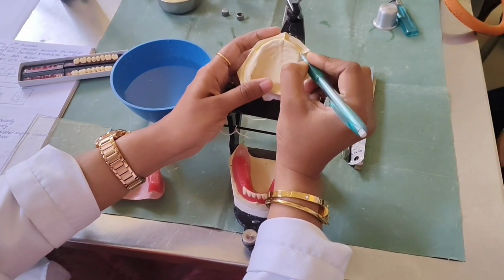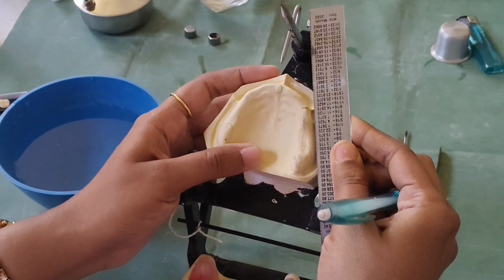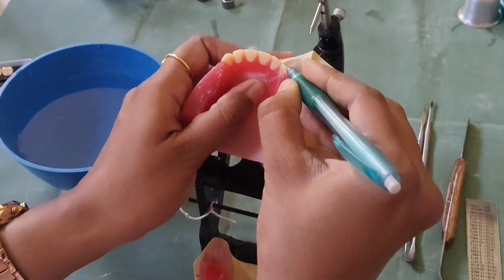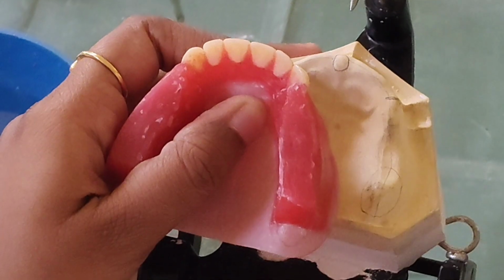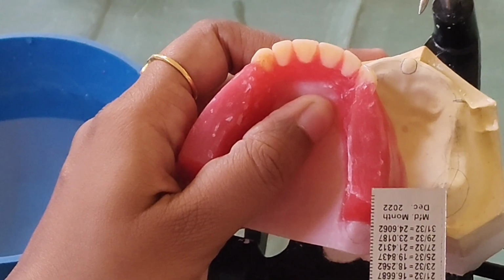See, here canine is there. So when we are arranging teeth, we have to keep the scale like this, on this part of canine. This part of canine is with the anterior, and this part will come with the posterior. This curve. So this part of canine we have to put the scale, and it should come in the same plane.